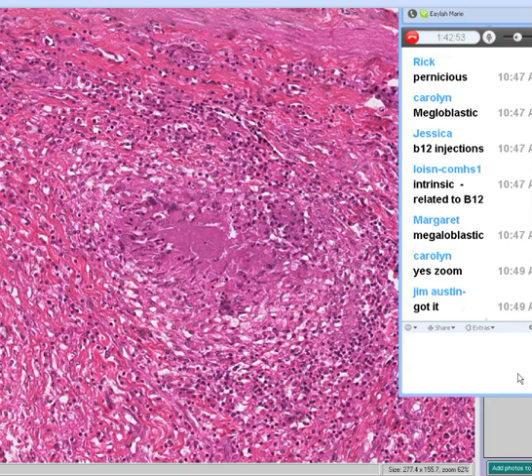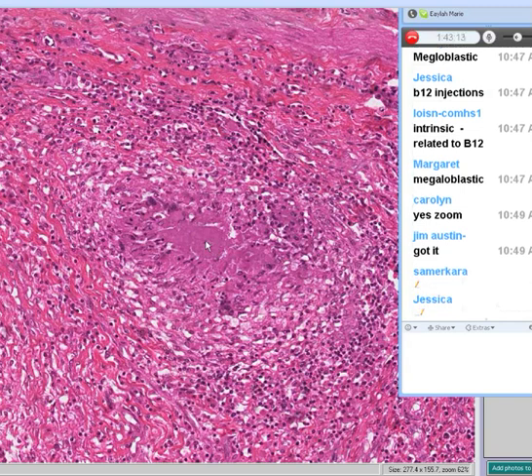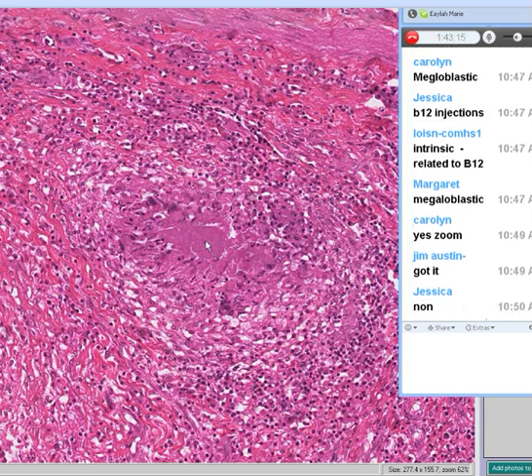Come on. These are granulomas. This is your classical day one granuloma 101. So if the granuloma had a necrotic center, would you call that a caseating or a non-caseating granuloma?